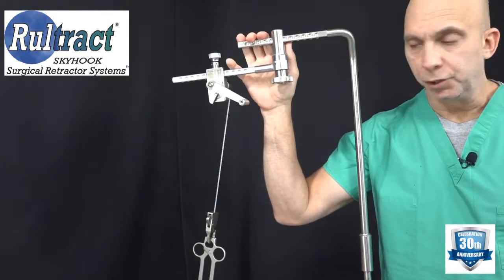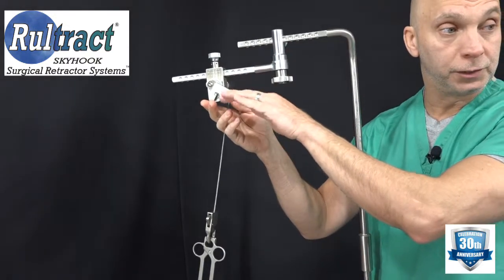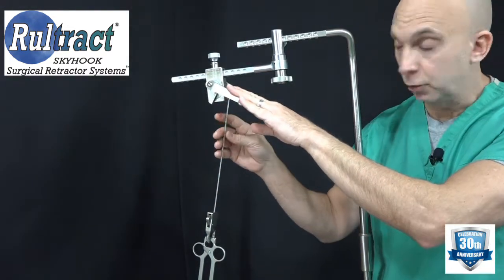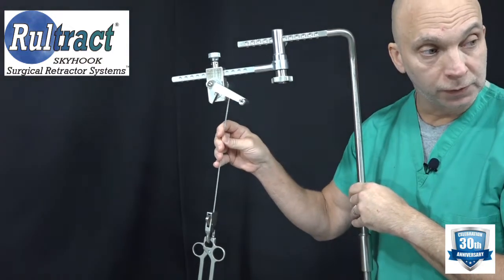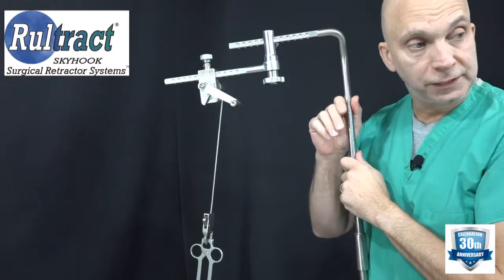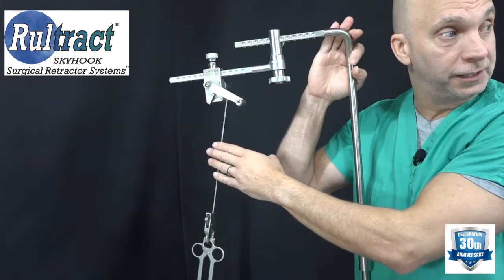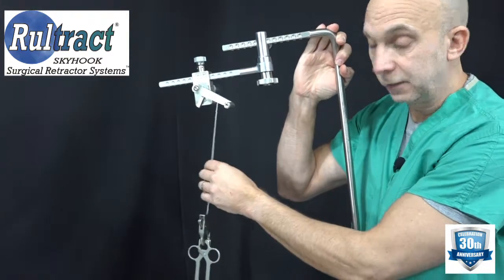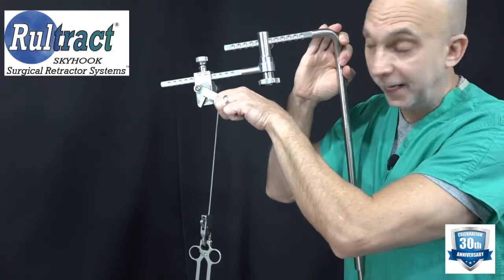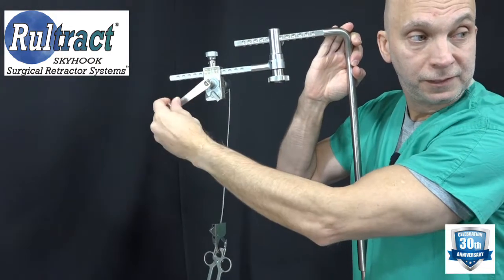If the surgeon is unable to release the lever while turning the crank handle, something that can be done to reduce tension on the cable — which will help switch the ratchet lever — is to simply lean on the top post. As you lean on the top post, you can see the tension in the cable is reduced significantly. Once you reduce that tension, still hold the handle, flip the lever, and then slowly lower.